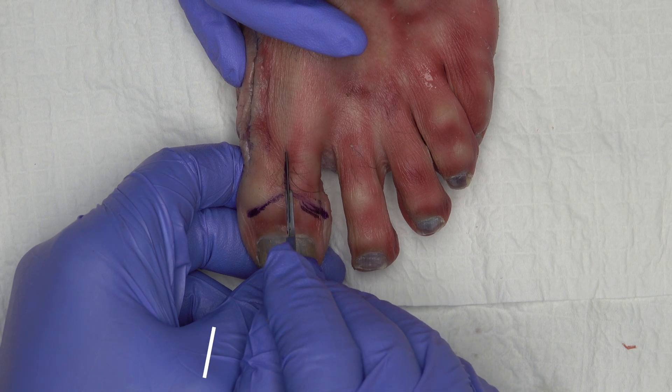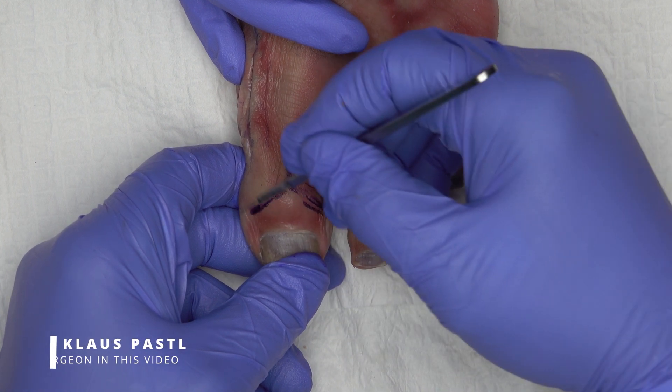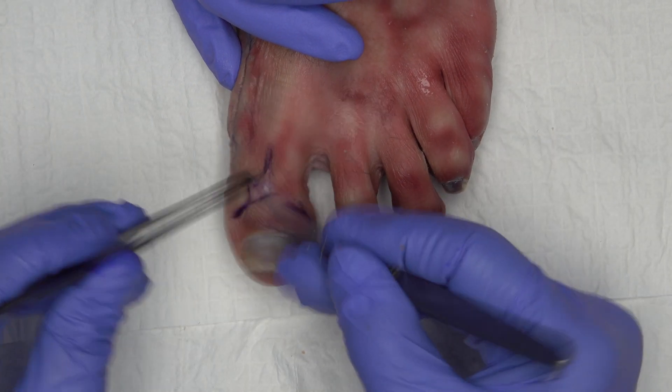Access is via a Y-shaped skin incision over the IP joint. The angle of the two distal legs should be as large as possible to minimize the risk of postoperative wound healing disorders.